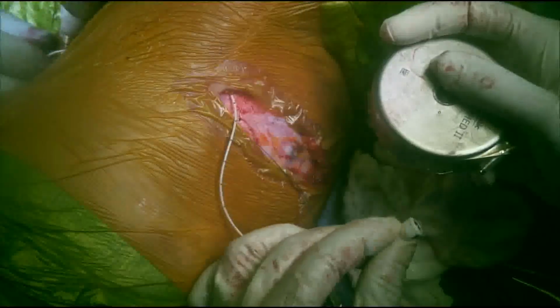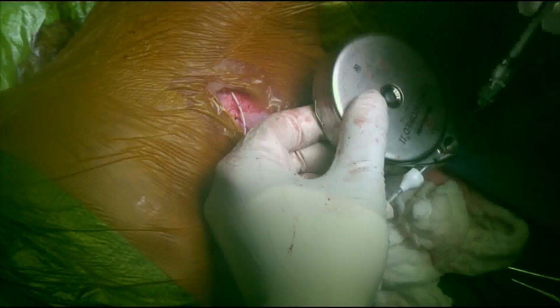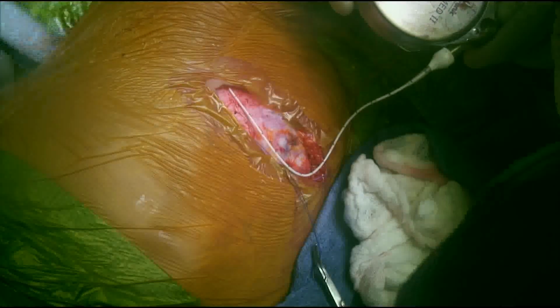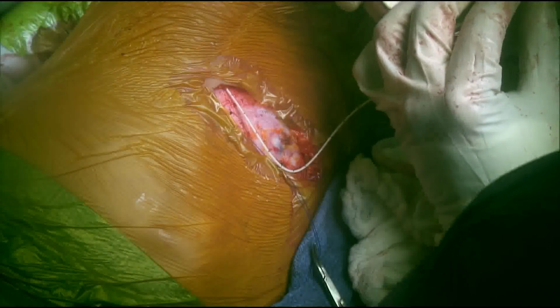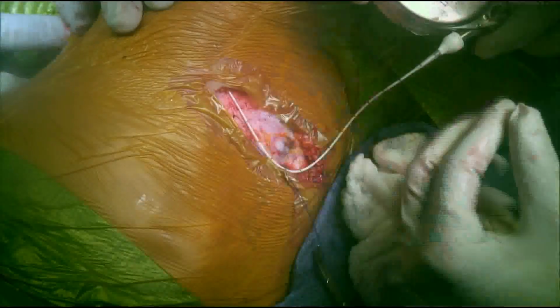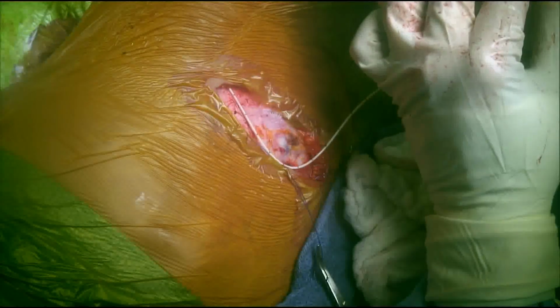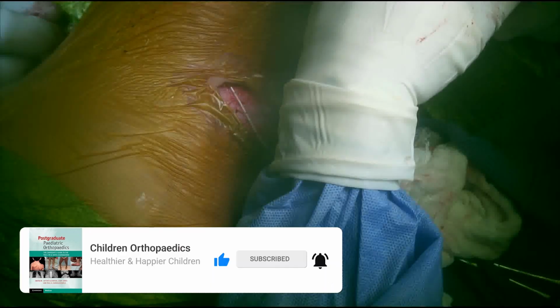The pump segment catheter can then be connected directly to the baclofen pump, and a small gauge needle can be inserted into the catheter access port to ensure that CSF can be aspirated. This confirms that the baclofen pump is directly connected to the intrathecal space via the pump-sided catheter and the spinal catheter. The pump reservoir can then be filled with intrathecal baclofen medication. Preparation of the intrathecal baclofen pump medication is usually done before the case is started.